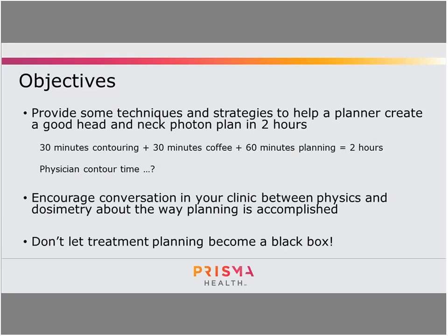I really don't want treatment planning to become a black box. There's a lot of different products coming out that do really great things, but it's really good to know what those products are actually doing. The more techniques we know, the better tool set we have. If you're cooking, you don't want to just know the recipe. You want to know what the ingredients are actually doing. So I'm just going to dive into the content.